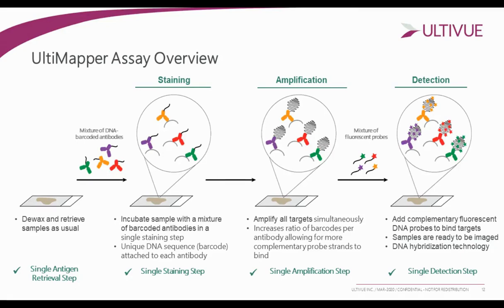In comparison, when you're using something like an HRP conjugate, that type of amplification is generally much more geometric, meaning it tends to hit saturation quite quickly. And that means your medium to high expressors tend to hit saturation quite easily, and it's harder to decipher or separate the range of expression between those types of cells.